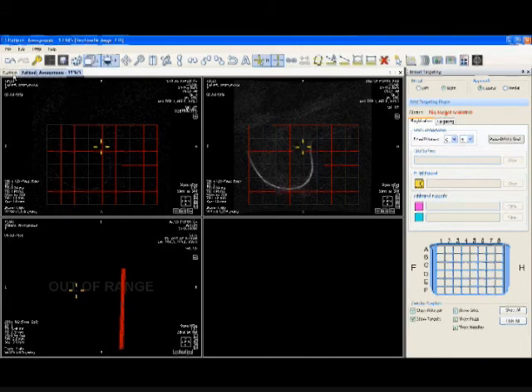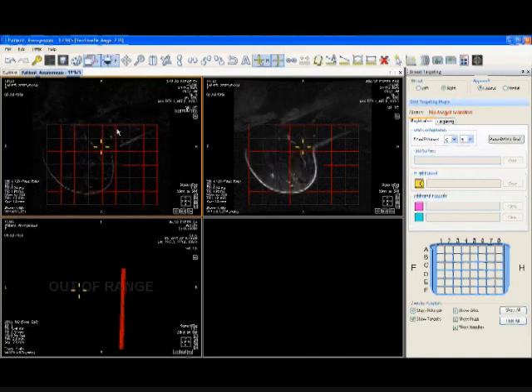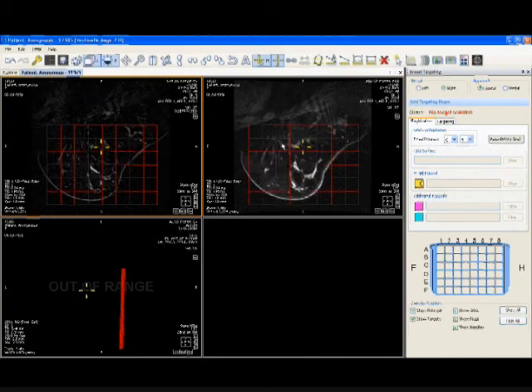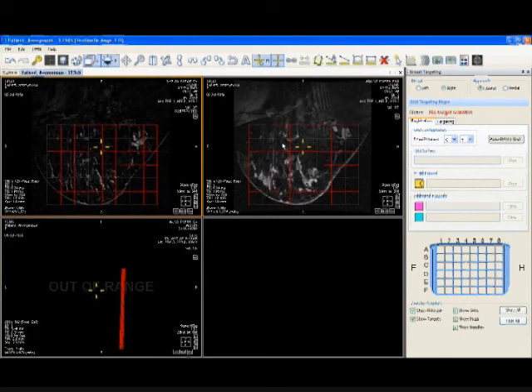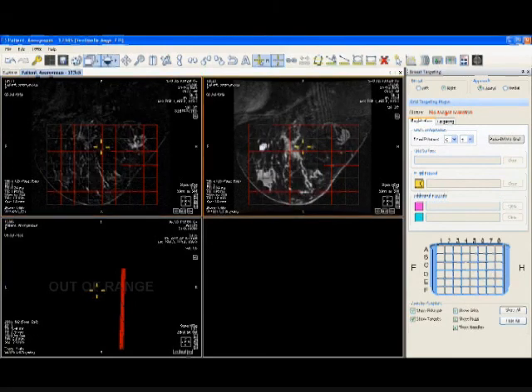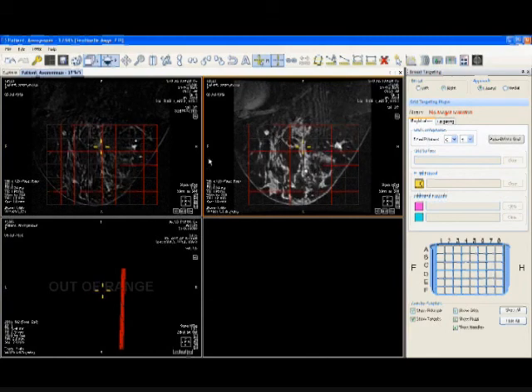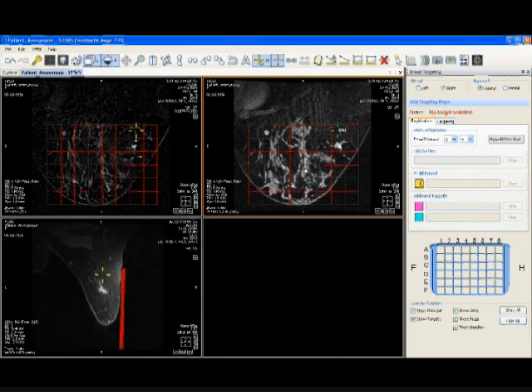And then we display this in a 4-on-1 display, as you can see here. In the top left, we have our subtraction images, and then the series of pre, post, and post-obturator and subsequently post-biopsy automatically get laid on one another. So you can see here is our lesion in this area. There you see the pre-contrast, post-contrast acquisitions. Also see it in the axial projection.